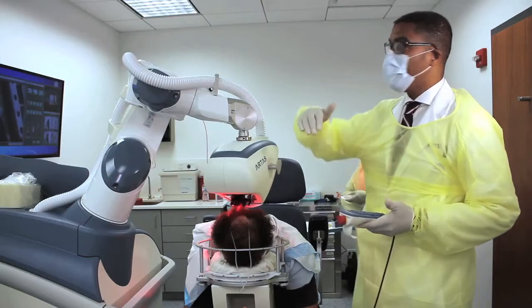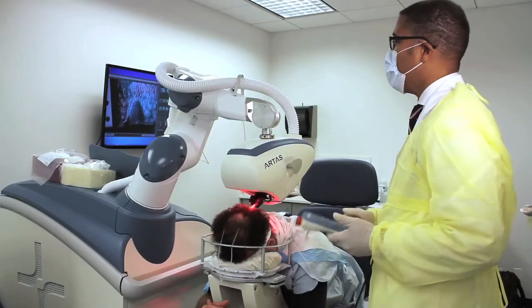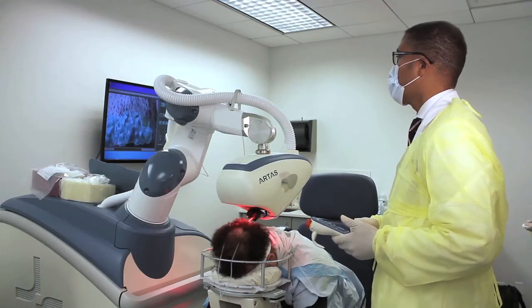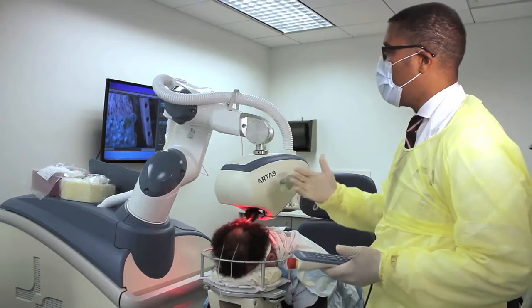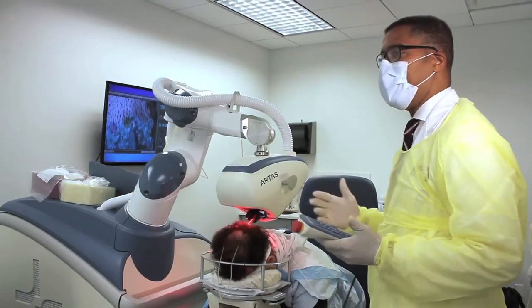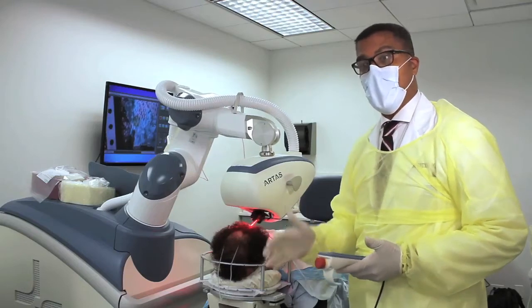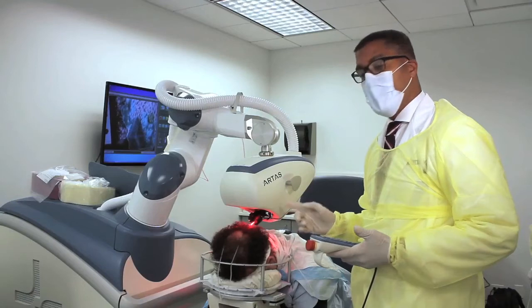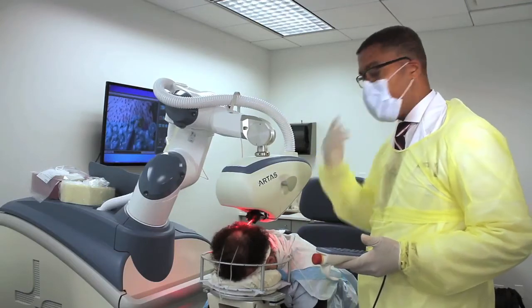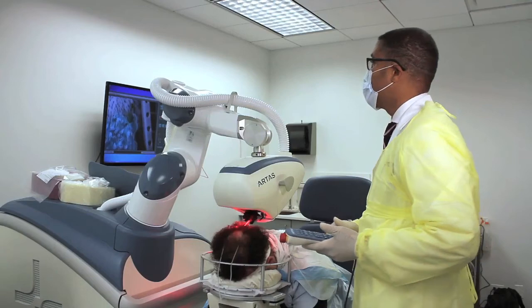Too shallow, too deep, too flat, too steep — that's basically what you have to do. The robot is selecting the hair with the green dot; the blue is where we've been before. Usually the area will decrease in density maybe 10 to 15 percent in each little grid, which to the eye — after it heals up and hair grows around it — you can't really tell. Whether you have a strip or FUE, the hair we take out from here does not grow back. The hair that we move grows up front. The hair back here gets thinned by the amount you take out. The way I say it: we're robbing Peter — this is Peter in the back — to pay Paul up front. You just don't want to rob Peter so much that he's broke and has nothing in the back. So it's selective robbing.